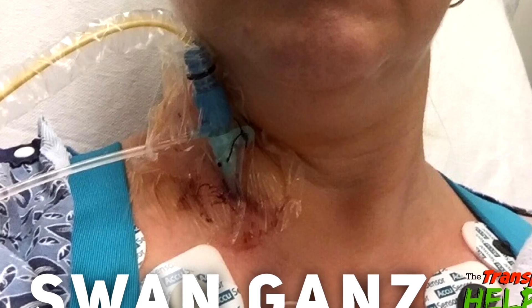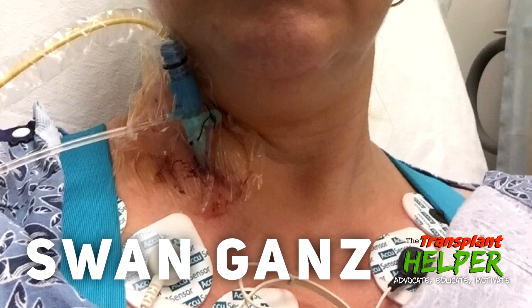Number one: what is a Swan-Ganz? The Swan-Ganz is also known as a pulmonary artery catheter, and as you hear in that name, it's placed in the pulmonary artery. Generally it's placed in the right side of your neck, though if needed doctors can take a longer route through the left. The Swan-Ganz is almost always placed in a surgical area because it has to be done in a completely sterile environment.